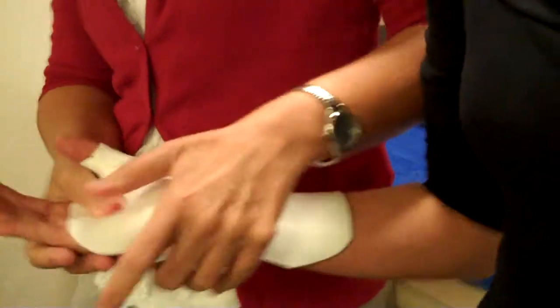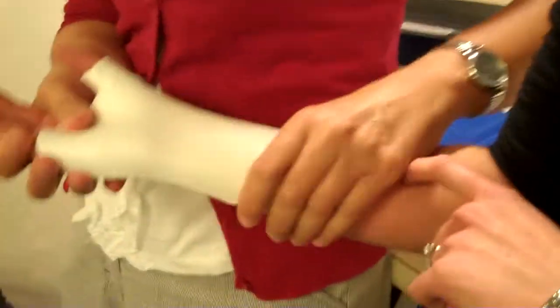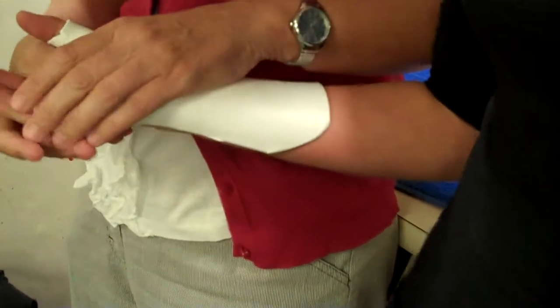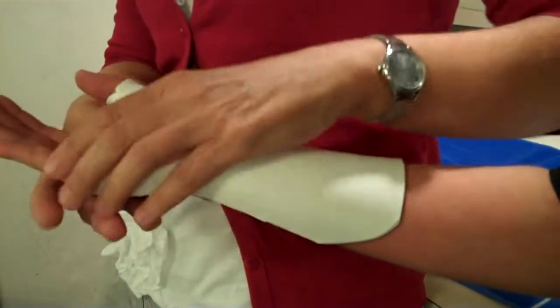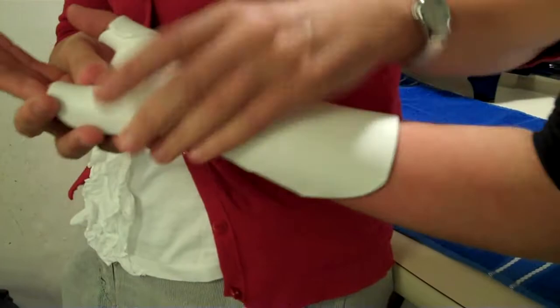Okay, now look how fast I'm working. I'm holding it down here on the forearm piece. Sorry. It looks good already. Ooh, it's hot. I'm putting my hand in the palm to keep those arches. Okay, I'm really working. I'm having to multitask, as Stephanie says she does well. So she's an awesome splint maker.